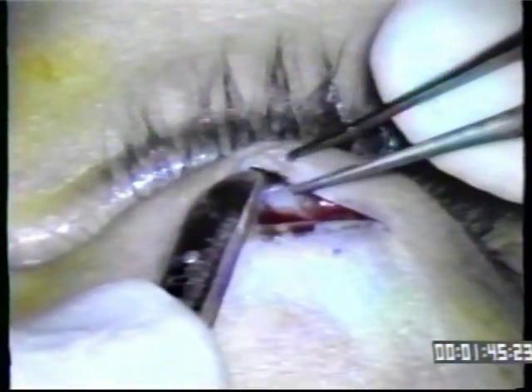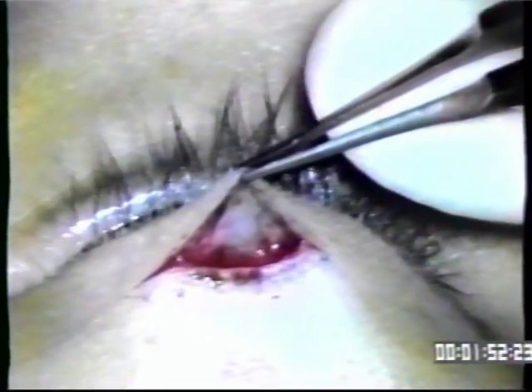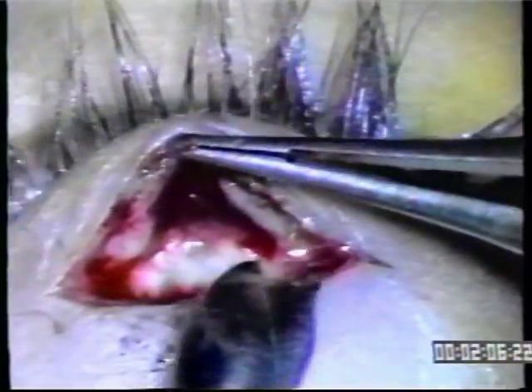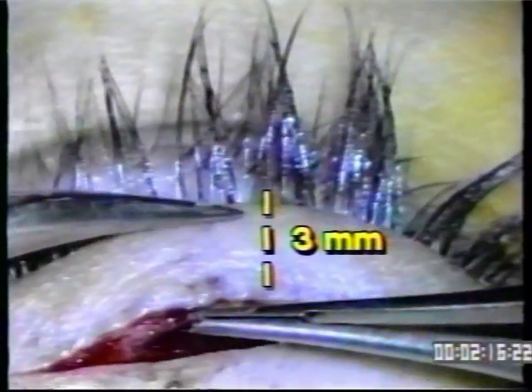We do not do any dissection by opening and closing the scissors randomly. Rather, we put the scissors in open, push down toward the tarsus, and then close. You can see that the eyelashes will move when you come down to the tarsus. You don't want to go beyond three millimeters above the lash line — stay three millimeters above to avoid disturbing lash growth and to avoid placing the gold in the thinnest skin near the eyelashes. The three millimeter rule is a good one.